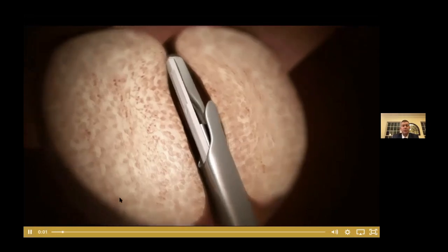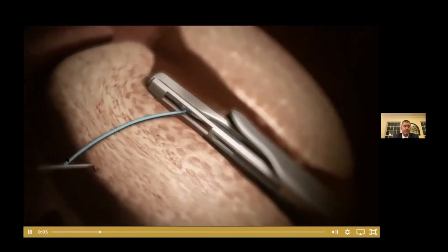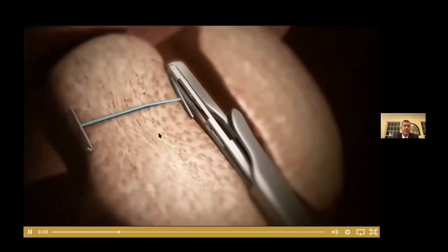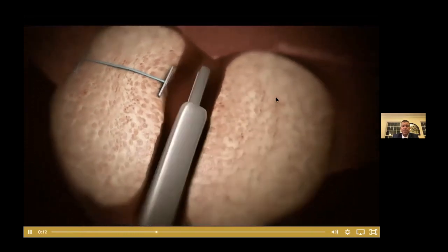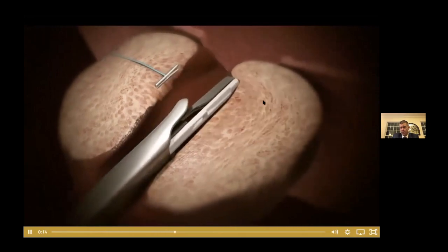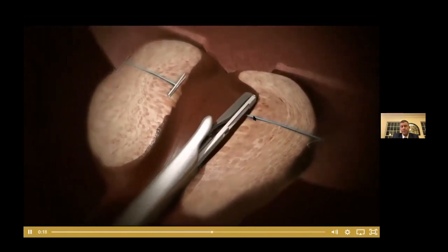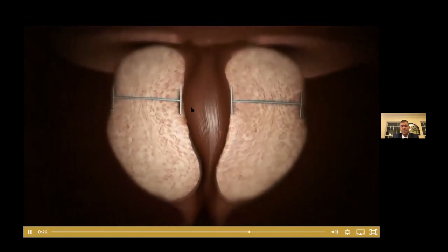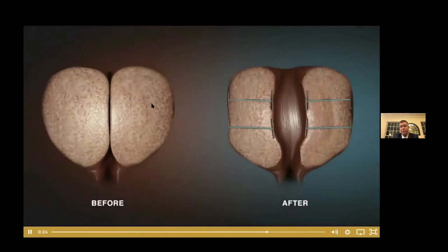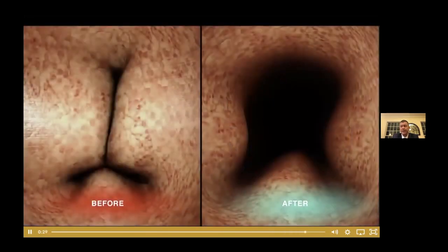So to do the procedure, essentially what happens is you compress the prostate, you deploy the base, and then you deploy the tip. You turn around, do it on the other side. Same thing, you get the anchoring one, the suture, and then the urethral side. And most people will get either 4 or 6 of these. Occasionally someone only gets 2, but most people are going to be more like this picture where you're going to have 4 or 6. And the idea of it is to open it up similar to that.